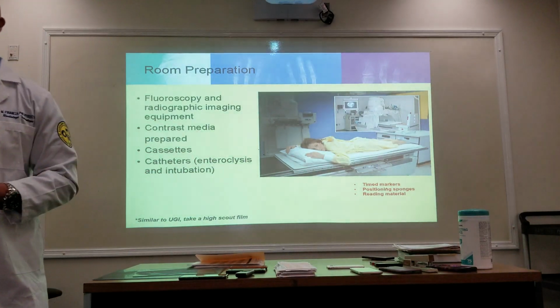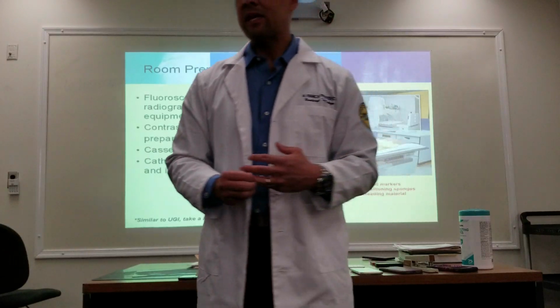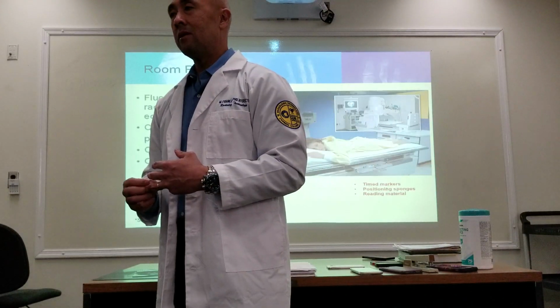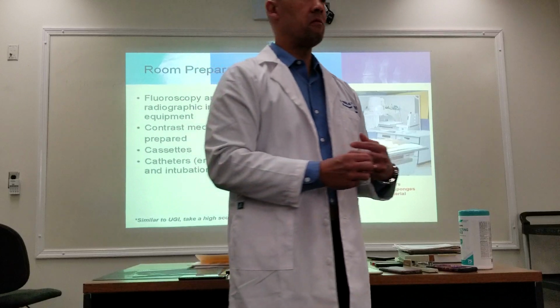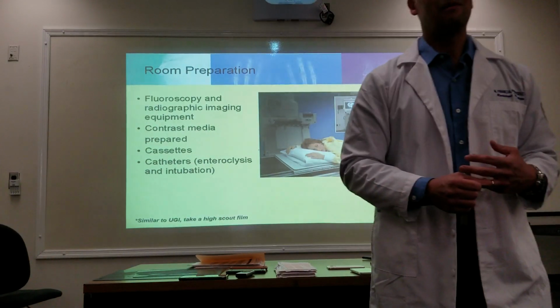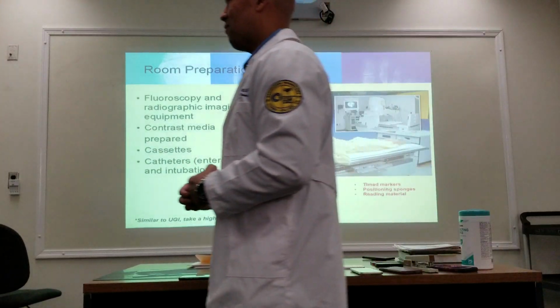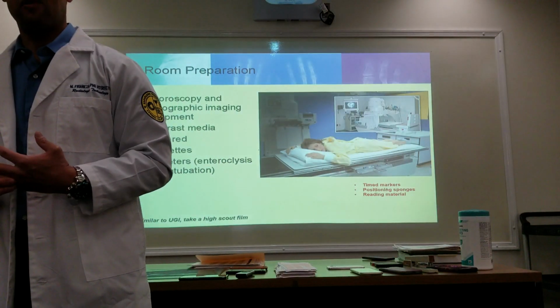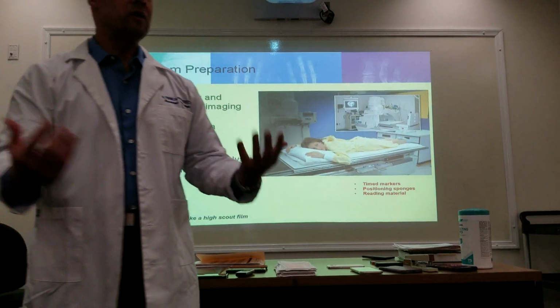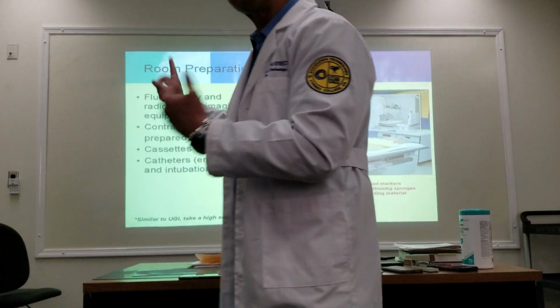Now, for an esophagram, the scout film is, what do you think it is? Like a chest X-ray. A chest X-ray. Okay, so the scout film for an esophagram is a chest X-ray. So this is the way it goes. And again, I wasn't able to explain this to you guys last week because I lost my visual cues.